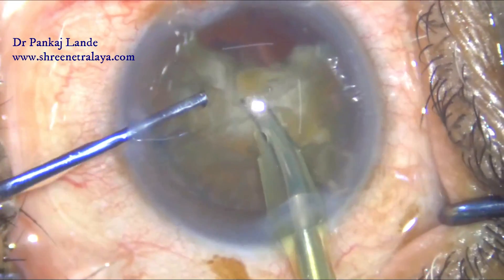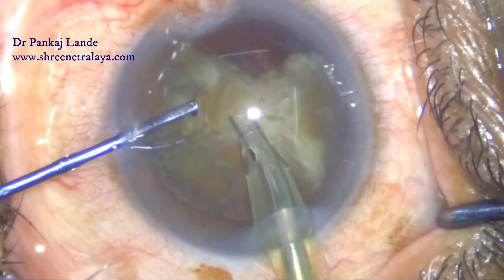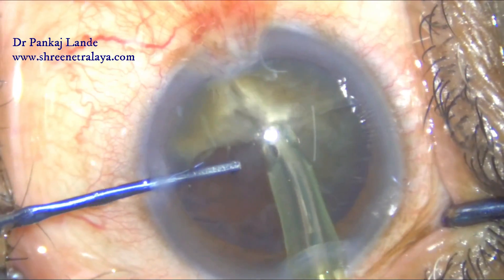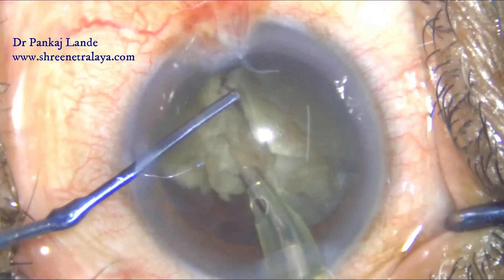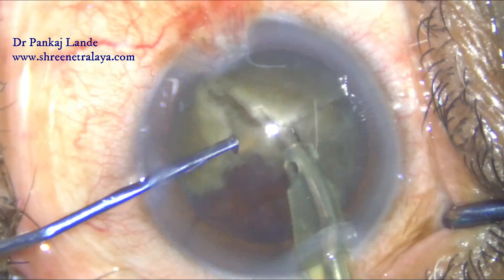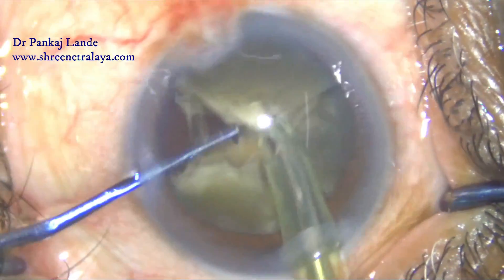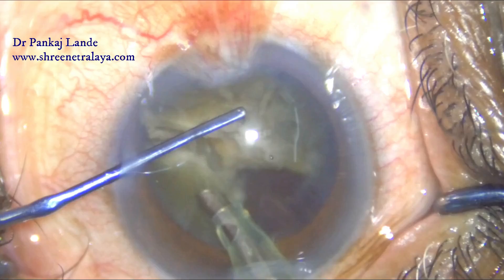You can notice the nucleus is a bit hard and leathery — it is not getting separated easily. If I had gone directly with phacoemulsification, it would have taken a lot of energy to divide this nucleus into four pieces.